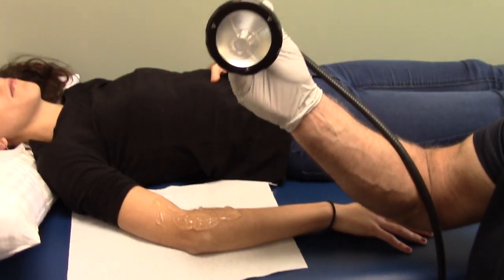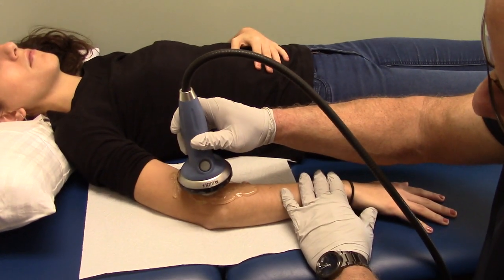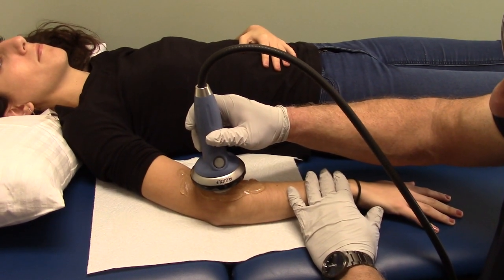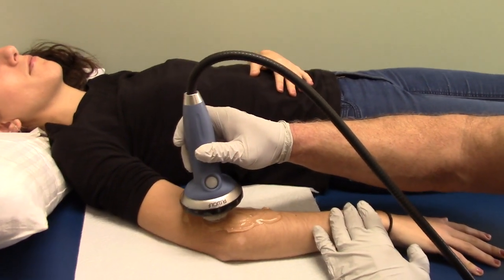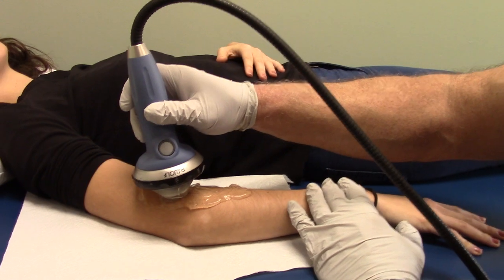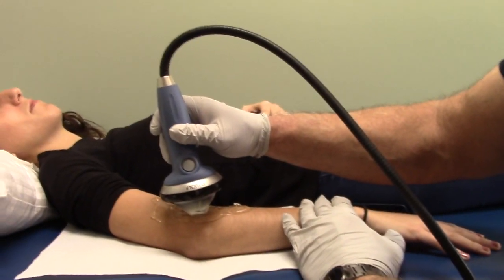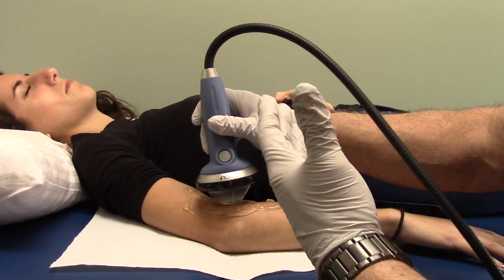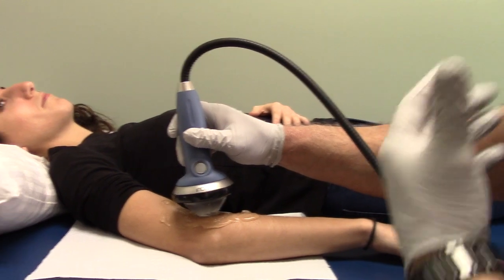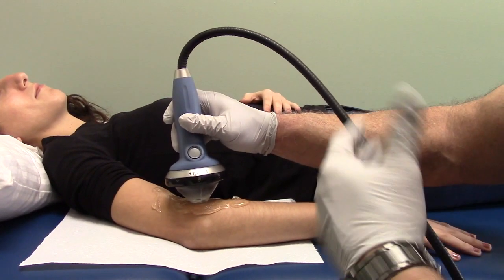What you're going to be hearing is these are the sound pulses. What we want to do is make sure that we hit all the lateral epi area where the radial head is — the proximal radial head. We slowly move the applicator around right where the injured area is, and we always want to ask the patient how intense it is, making sure we go to their tolerance and not above that.